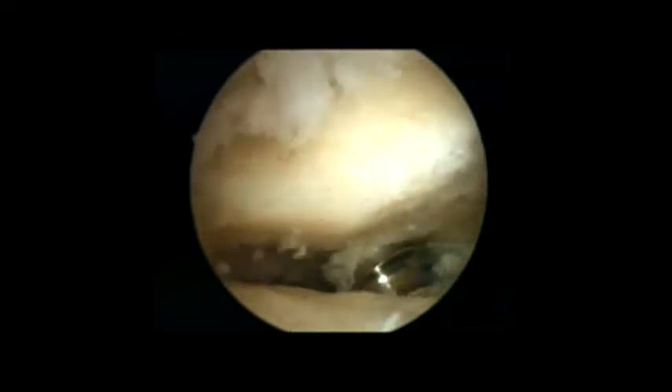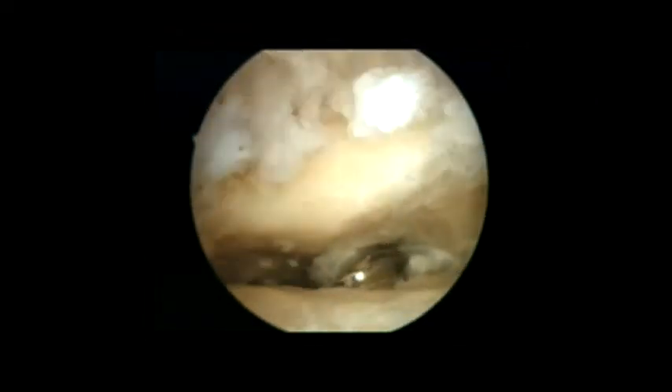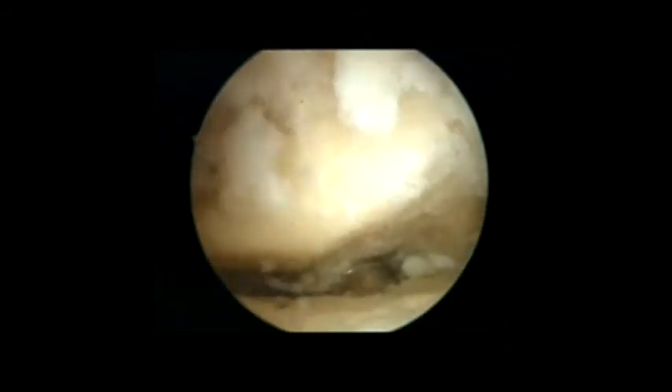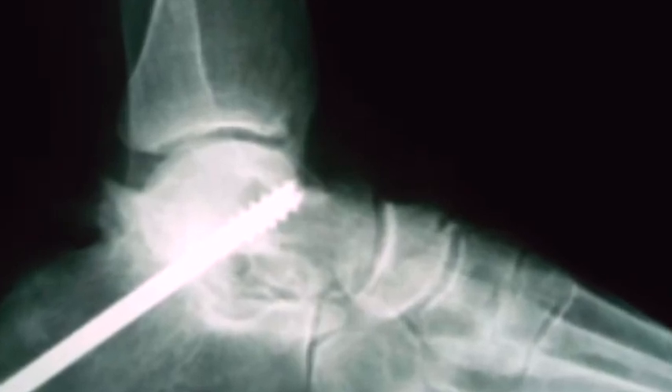When the articular surfaces are prepared, we introduce the needle guide for the 6.5 millimeter cannulated screw under direct visualization and fluoroscopic control. Co-aptation of the articular surfaces is confirmed, completing the arthrodesis fixation.